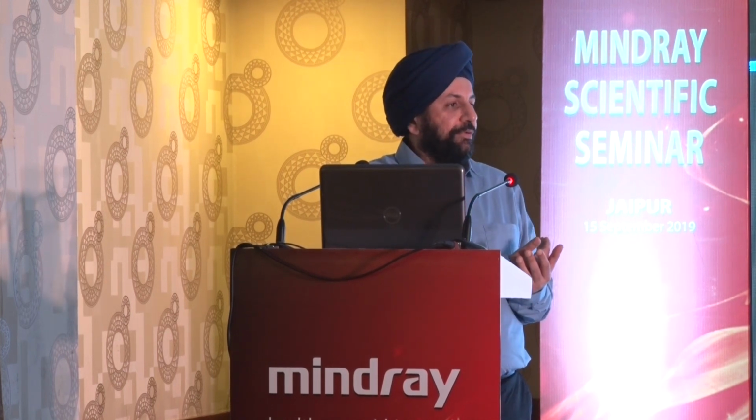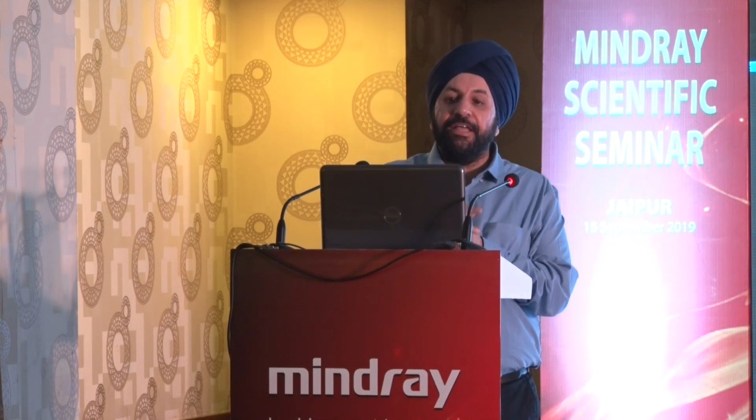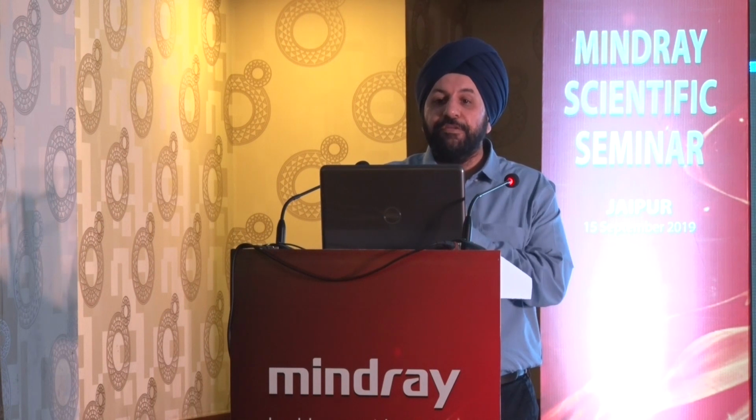This patient, in addition to having dengue, had another problem. This was a patient of Harris platelet syndrome, which is very prevalent in eastern parts of India. That is why it had macrothrombocytosis. And that is where the question that you asked me about IPF comes in: the ballpark figures are often misleading.